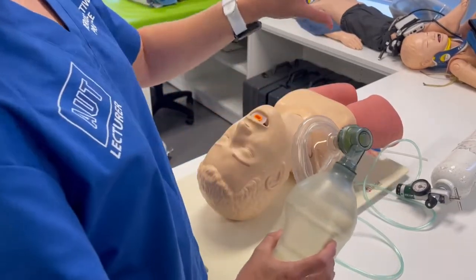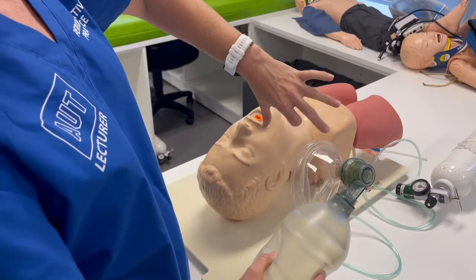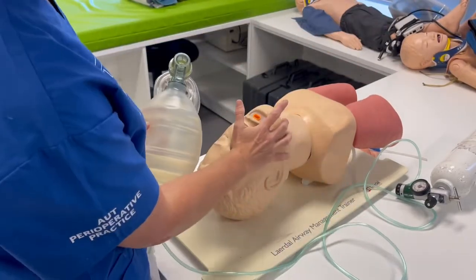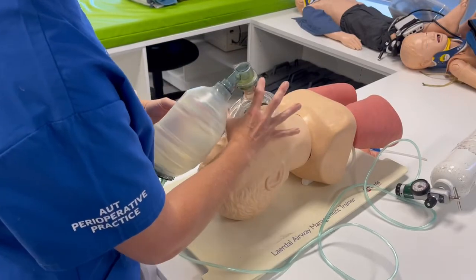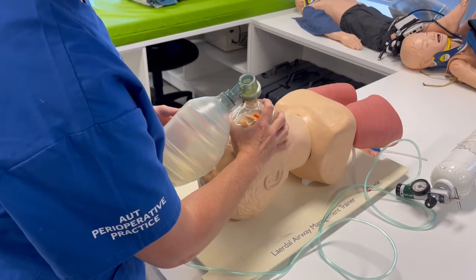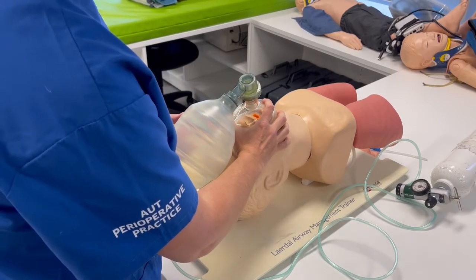With a C-E grip, hold the mask with the C formed by your hand, and then the E of your fingers lines up along the angle of the jaw. The C goes around the mask, and your fingers go along the jaw — not the soft tissue.